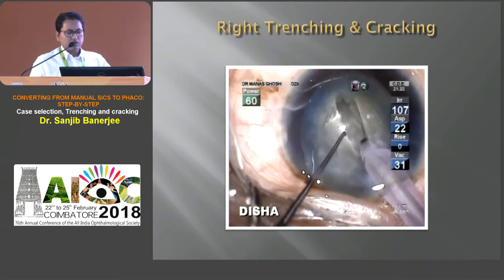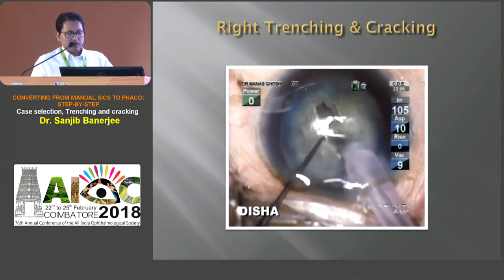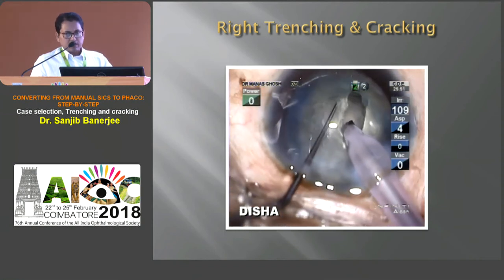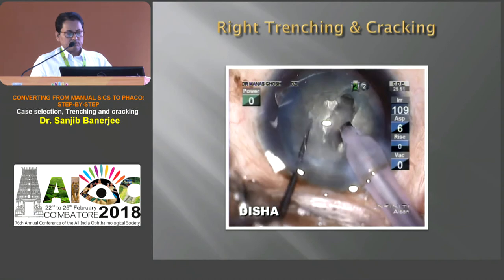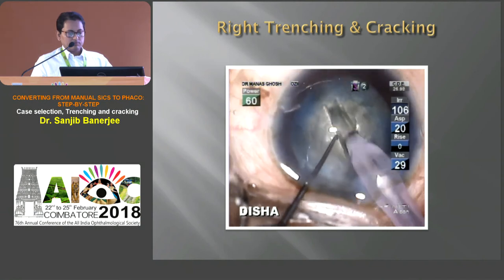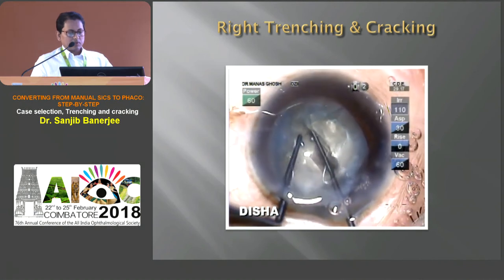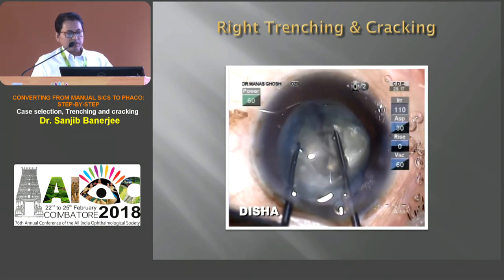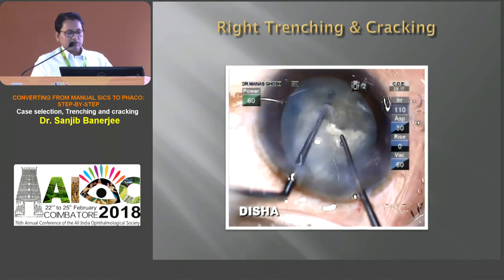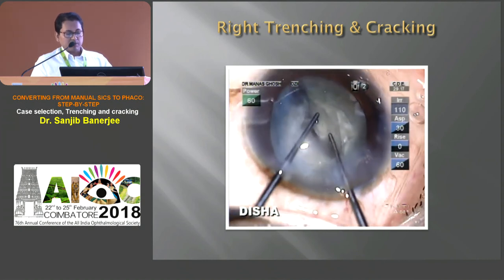During deep trenching, we need to refocus the microscope to see clearly. And sometimes we need to repeat this step to get the desired depth of the tunnel. When the desired depth is reached, place two instruments at the periphery and cracking is initiated. And if it is incomplete, rotate the nucleus 180 degrees, and the cracking is completed from the other side.